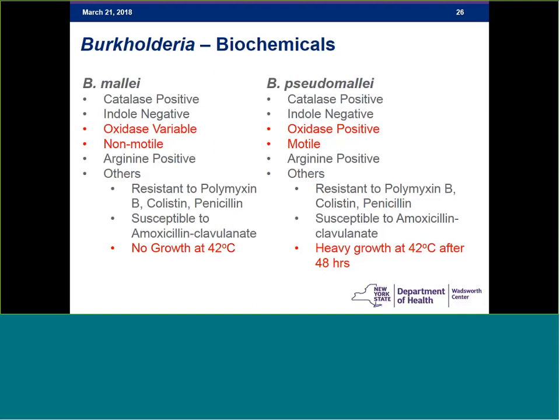For example, last year we were notified of a potential B. pseudomallei isolated from a canine that was adopted from Thailand, but this organism ended up being non-motile. Additional characterization, including whole genome sequencing, was performed to confirm that this was indeed B. pseudomallei. This is a perfect example as to why notification to an LRN laboratory is so important.